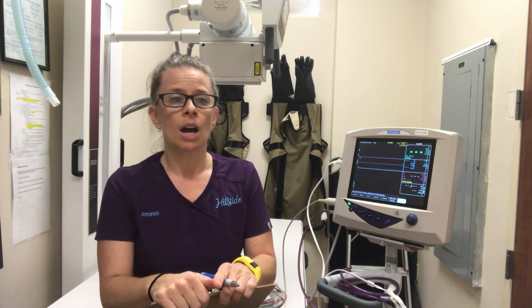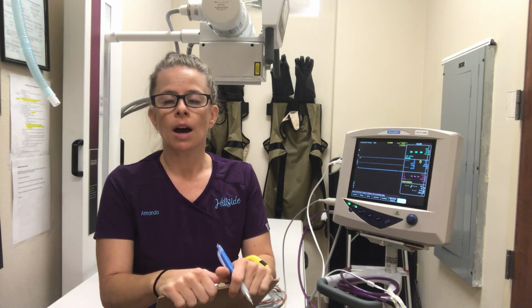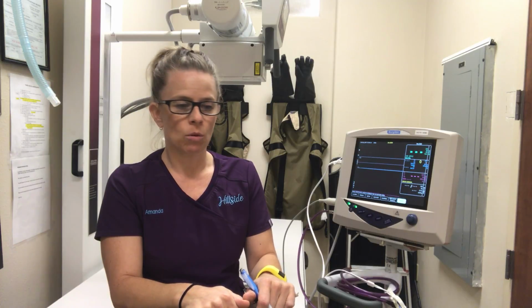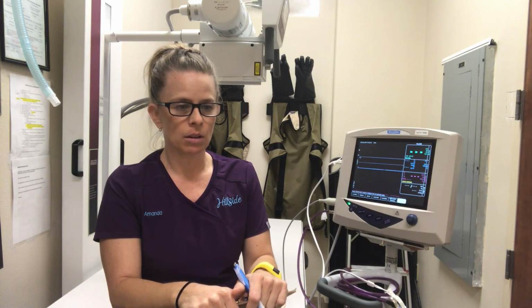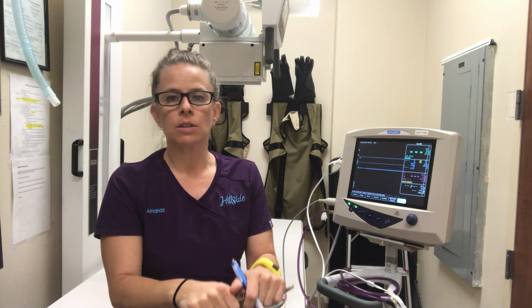You want to check for AV heart blocks, PVCs, anything that looks abnormal is recorded on this machine, and we are able to know that that is happening, alert the veterinarian, and be able to either reverse that with medications and/or wake the patient up if we can't get it corrected, for sure. So definitely want a nice strong heartbeat, nice strong rhythm. You want good P waves, solid QRS complexes, and good T waves. So anything abnormal is reported.